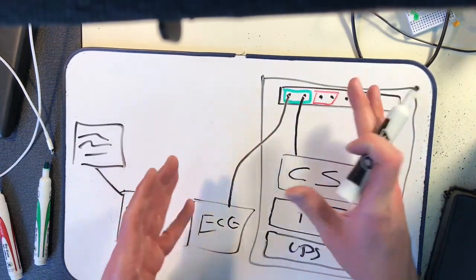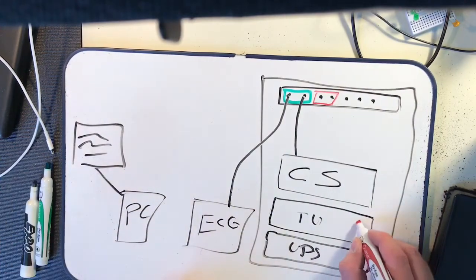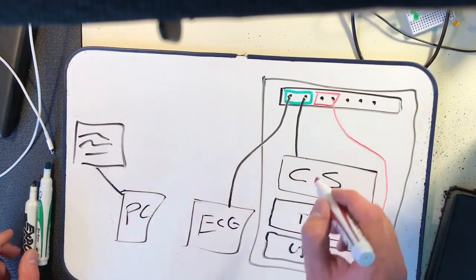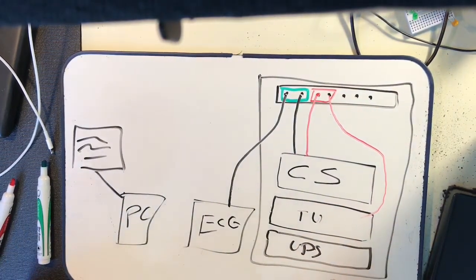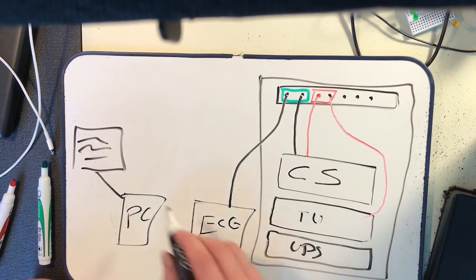So these are essentially connected directly to each other through the switch. Now we have the telemetry unit come up with its Ethernet port into the switch, and then the second port from the central station goes up to that VLAN. And that's how it has to be set up to work. I'm not sure exactly why that is. That's just how the documentation defines it.